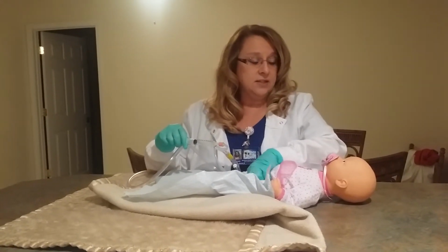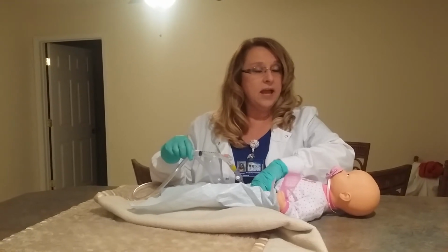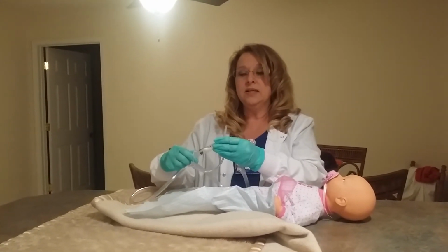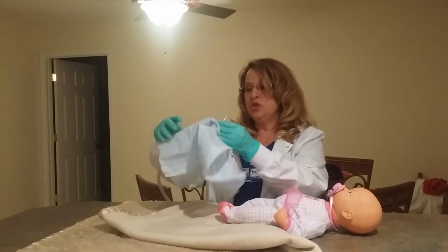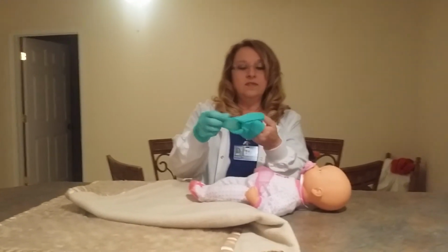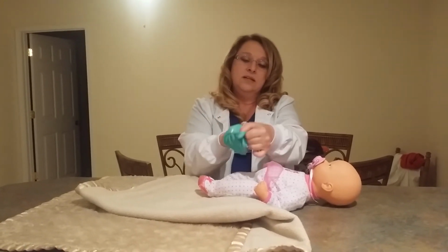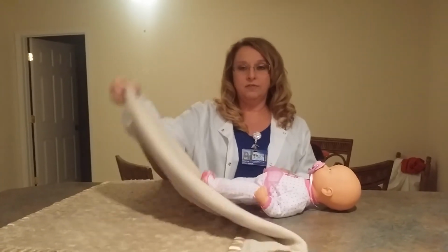Okay, Ms. Smith, take a slow, deep breath in. Now exhale it. As the patient exhales, you will pull the tubing. Be sure and hold that end up high to avoid any splash or leakage. Gather up your trash. Dispose of in the proper receptacle. Now we'll take off our gloves in this manner. Ball up this one, put it in the palm of this hand, taking this one off, covering over it, also disposing of the glove.